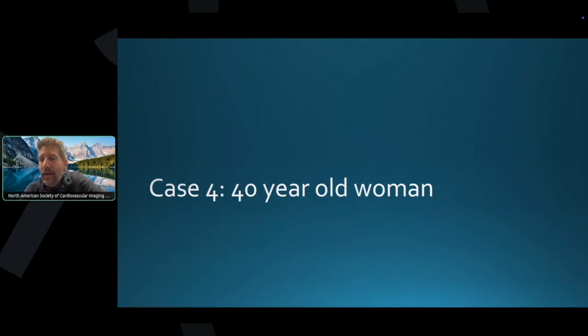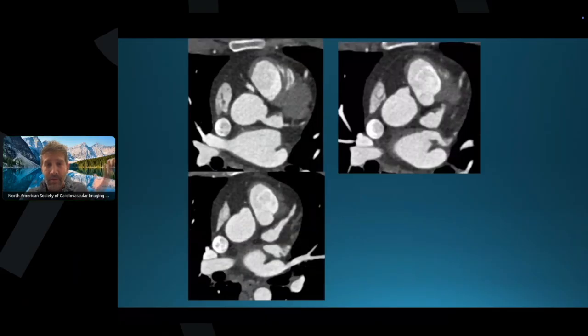All right, case number 4. I honestly don't even know what case is coming, so it's going to surprise you guys as much as I'm going to be surprised. A 40-year-old woman. Okay, I'm going to let someone take it. If anyone wants to go over it.